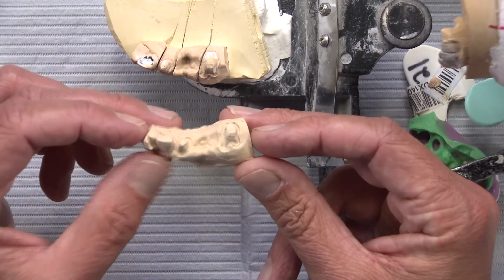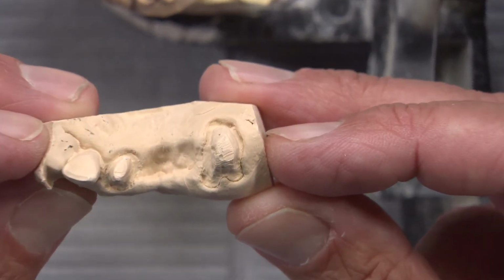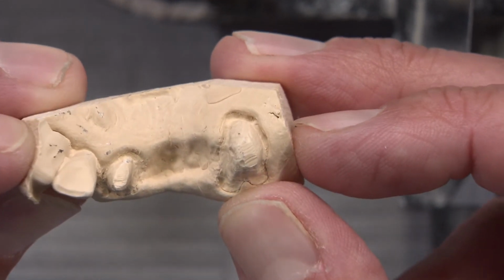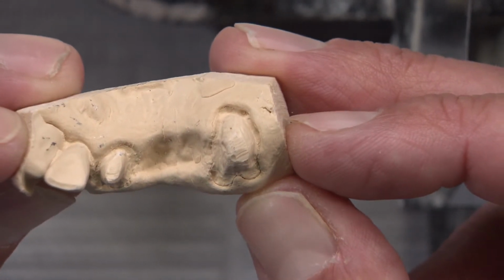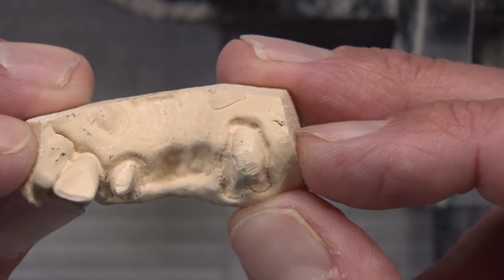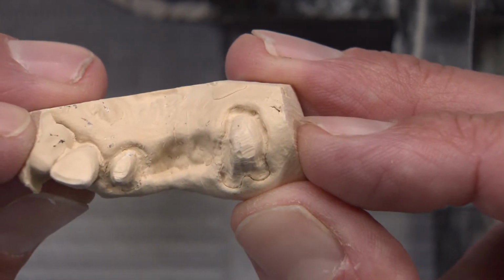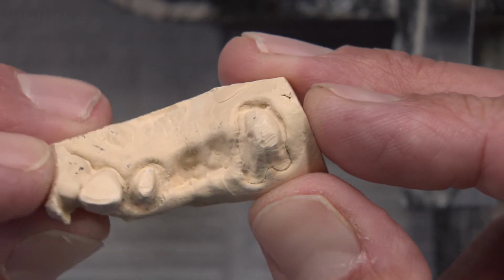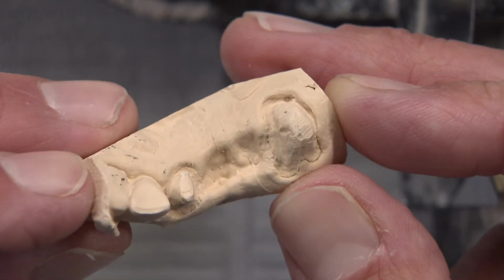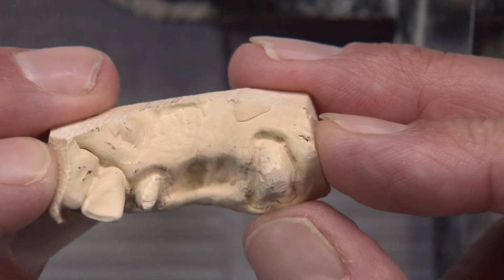If we take a little closer look and zoom in a bit here, this is the solid model from that case. And you can see on the buccal, I mentioned the areas where there was a little bit of flash beyond the impression. When the technician goes to trim it, there's a clear demarcation between where the gingiva is and where the tooth is. That makes it very easy to trim. We come over on the lingual, and it gets a little bit tougher because there's no space. You can say to yourself, well, I can see where it is. Well, I know, but when you go to trim it, it falls apart as it comes to that area, versus actually having a space like we do on the buccal.